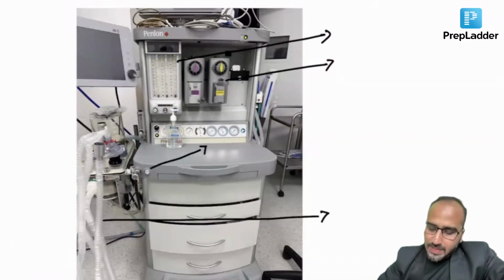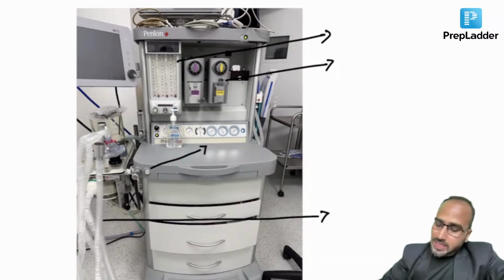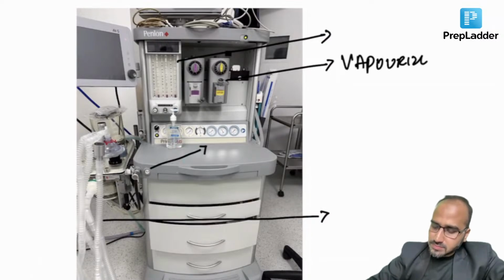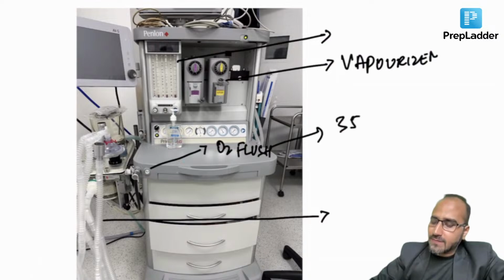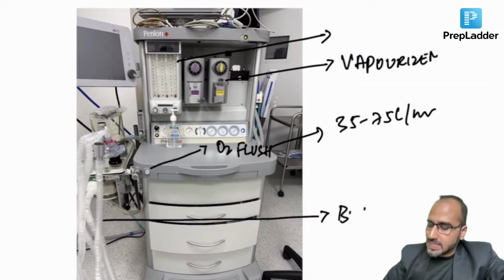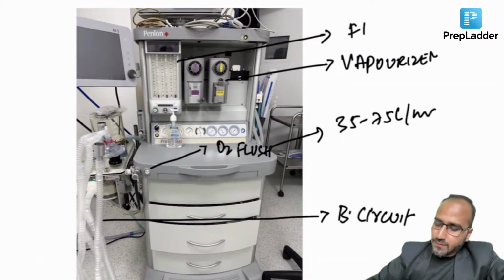Now I have labeled some parts of the machine, guys. What are the parts? This part is called the vaporizer. This part over here is called the oxygen flush. Oxygen flush will deliver how much oxygen? 35 to 75 liters per minute of oxygen. The part labeled over here is the breathing circuit. And this is the flow meter.